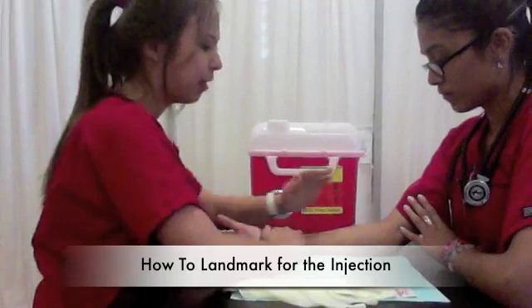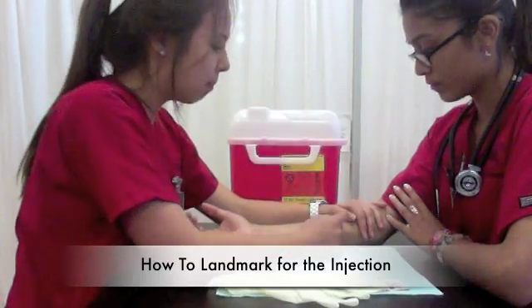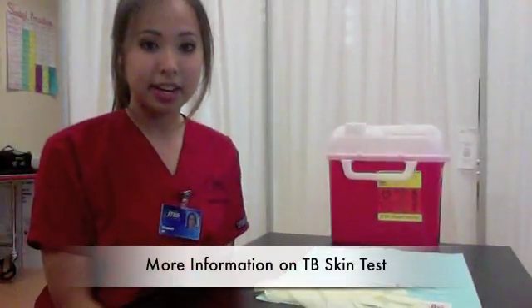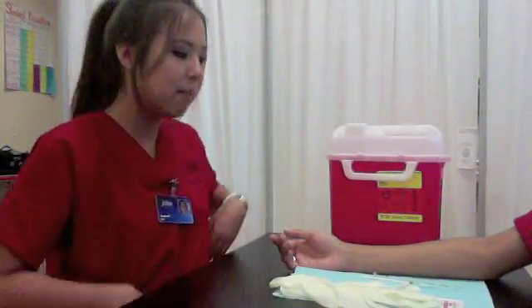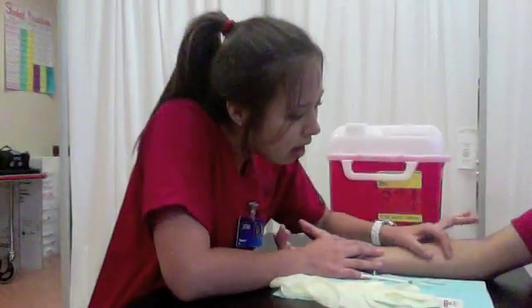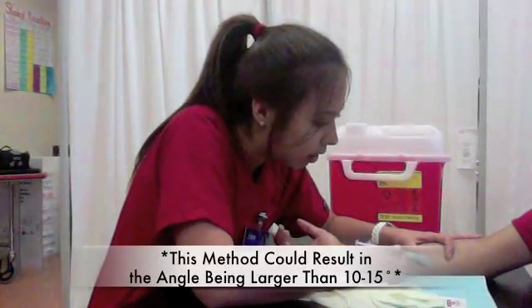You put one hand over the wrist and one hand over the elbow. The open area is where you can give the injection, but you need to avoid any areas with veins and hairs. A TB test is an ID, or an intradermal injection, given at a 10-15 degree angle. When giving an intradermal injection, you need to make sure you're pulling the skin taut, but avoid holding it taut in a way that interferes with the angle of injection.